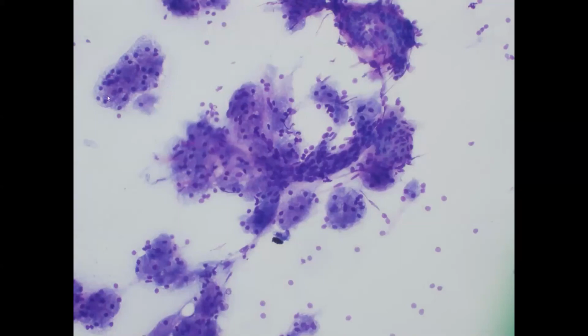So whenever you see these nice balls, these little spheres of acinar cells, that's going to be your clue, even in a very scanty aspirate. If you're lucky enough to have these larger fragments, again, you can see this arborizing growth pattern, and you can see the arrangement of the acini around the striated and the intercalated ducts, as well as some blood vessels as well.